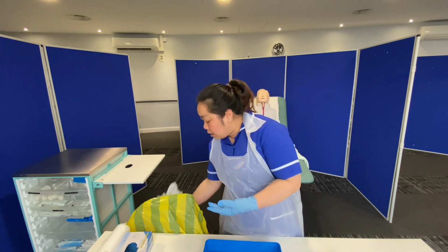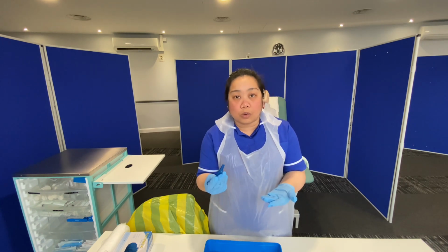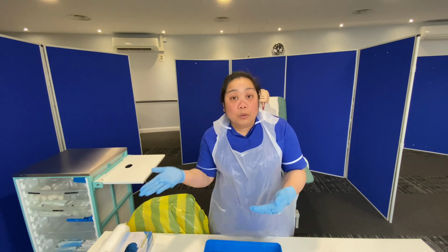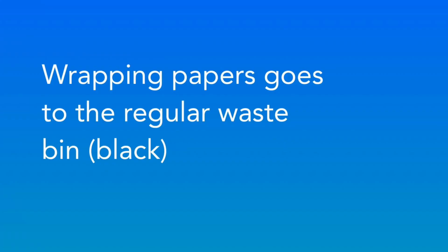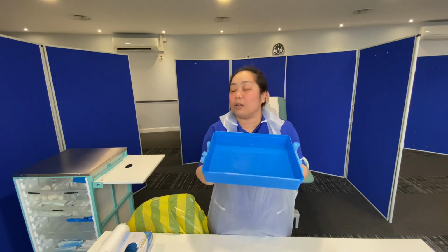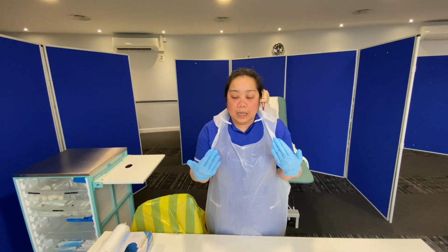So for disposal of the materials that we used, the underpad and the used Clinell wipes go in the clinical waste bin. If the non-traumatic clamp is also disposable, this will also go in the clinical waste bin. I've already discarded my 10 ml syringe earlier in the clinical waste bin as well. All the wrappers will go in the regular bin. And because our tray is disposable, I will also put this in the clinical waste bin. Once that is done, I will discard my PPE.